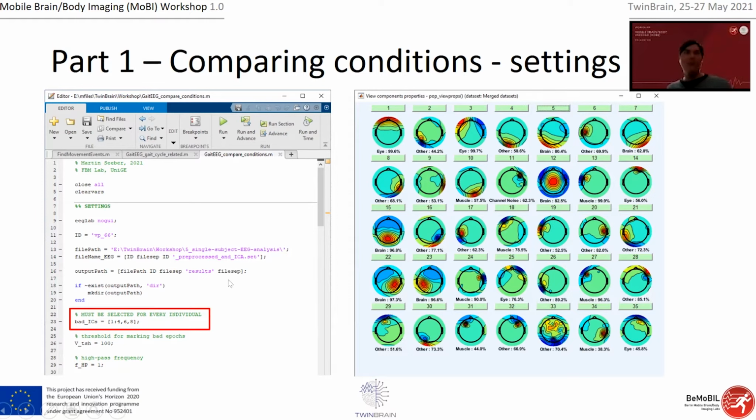So I just came up with: okay, let's remove the worst components I know in this data set and try to get something meaningful afterwards. I think the essential difference between these two ways of using ICA is whether you do back projection or not. If you do back projection, I think you have to aim for a high dimensionality of your data.